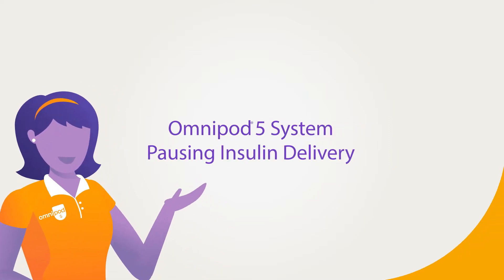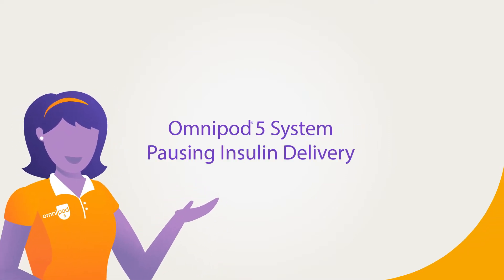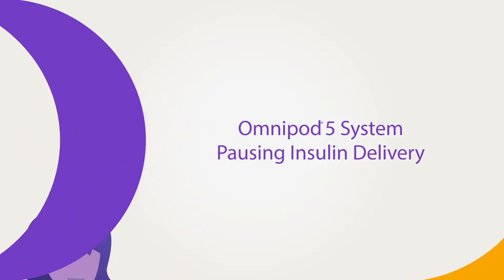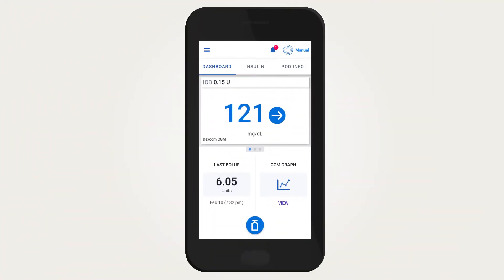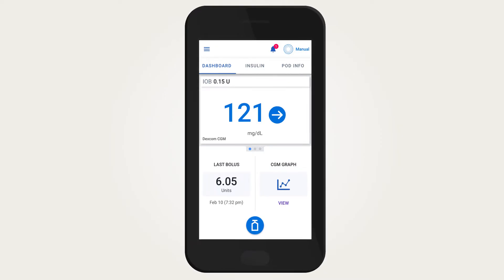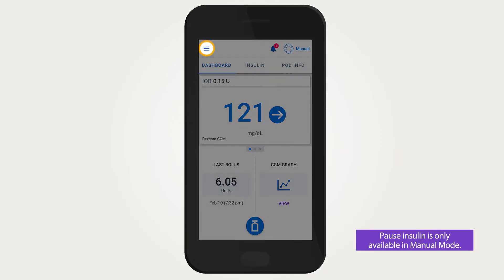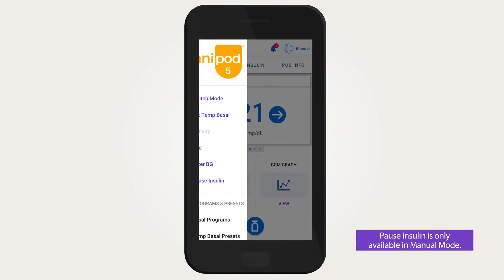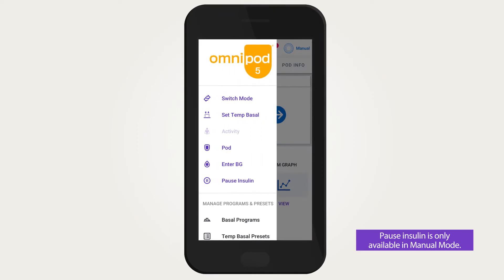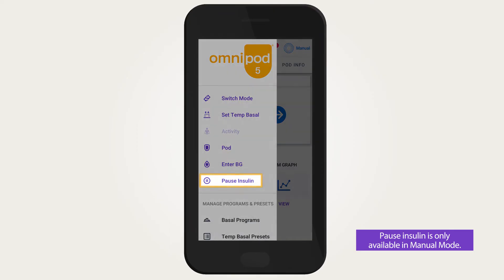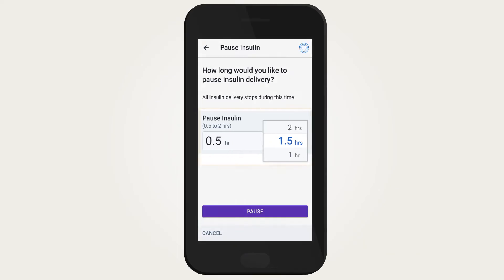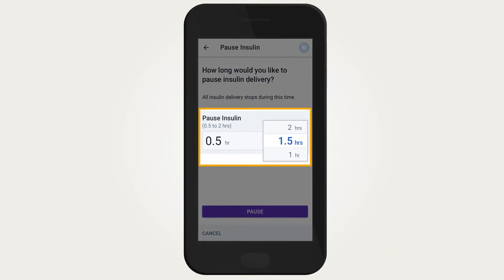Omnipod 5 system: pausing insulin delivery in manual mode. Basal insulin delivery is based on your entered basal program and does not change with CGM values. If you want to pause basal delivery in manual mode, first tap on the menu button. Once the menu expands, tap on pause insulin.